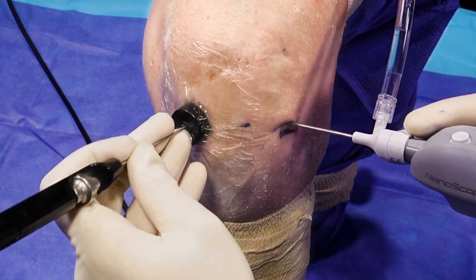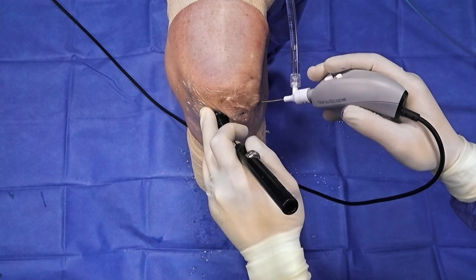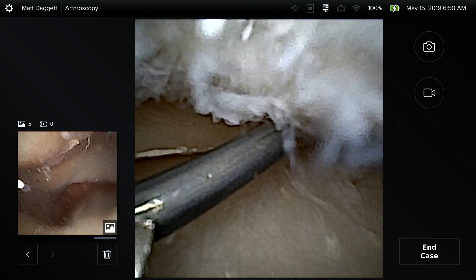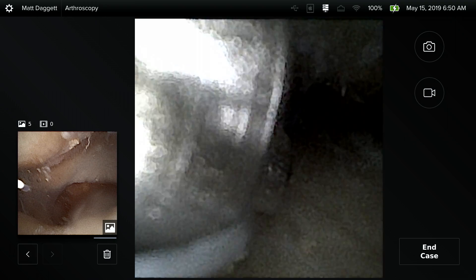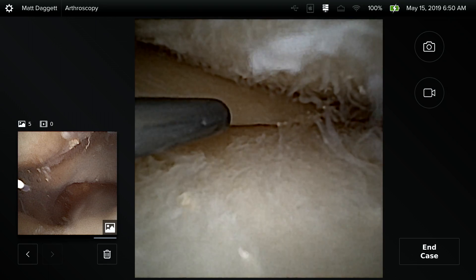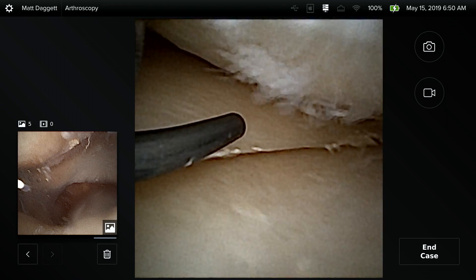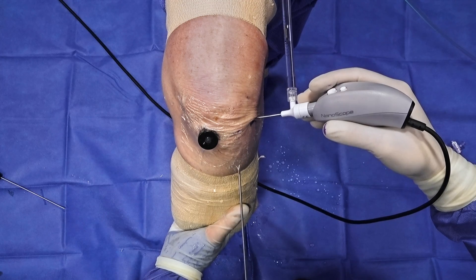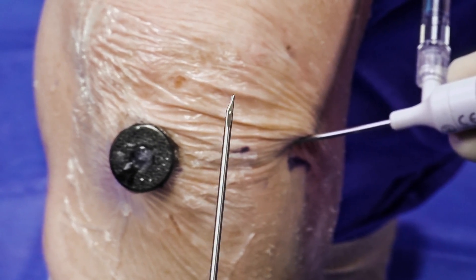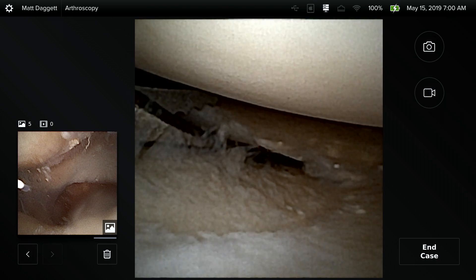Next, we're going to insert the nitinol probe through the cannula. This will allow us to better inspect tissue before we move on to addressing the pathology. The nitinol probe allows for varying degrees of depth as the button on the outside allows us to increase or decrease the amount of probe coming from the instrument. After we've thoroughly probed, we can then insert the nano straight biter as needed, or other nano instrumentation, back through the cannula and into the knee.